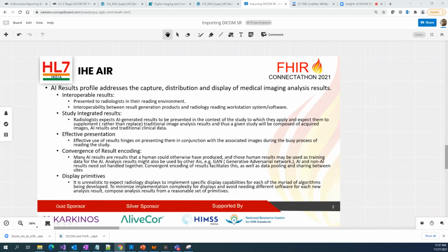How do you share the information? So that you have participating systems, we call them actors, for example. In the PACS workflow, you have a PACS system, you have a radiology display system, you have modalities. How do they work together?